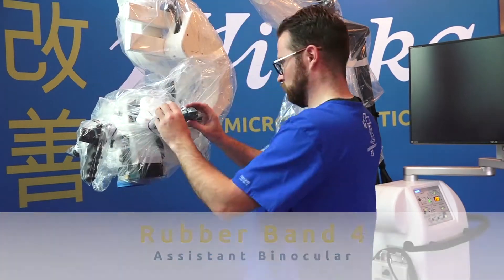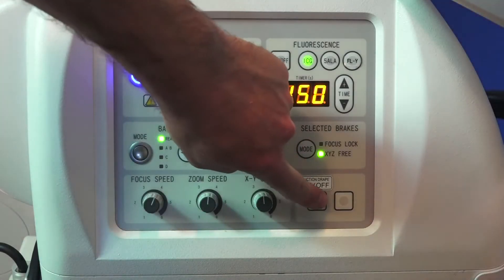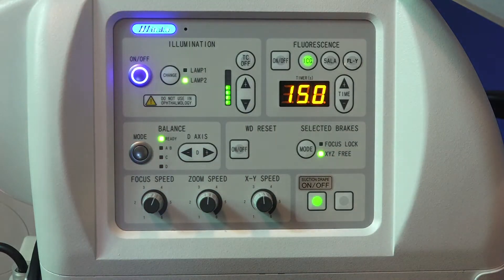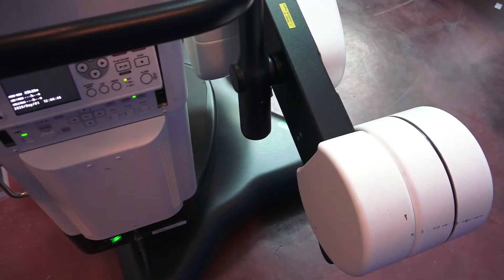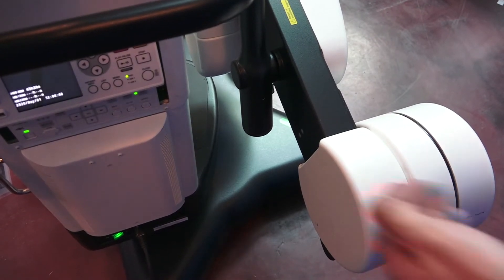To activate the vacuum drape, simply press the vacuum drape button on the microscope control panel. To be sure the vacuum drape is functioning, test the exhaust port for the movement of air.